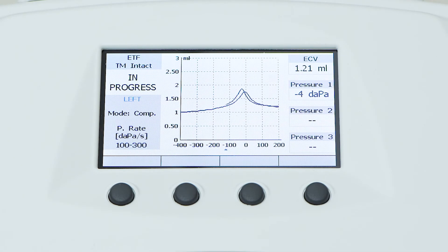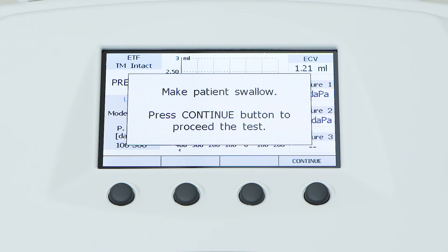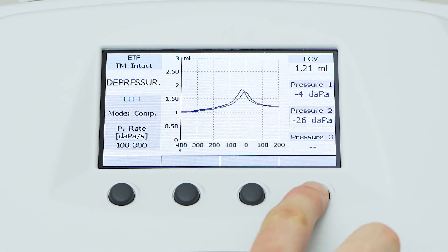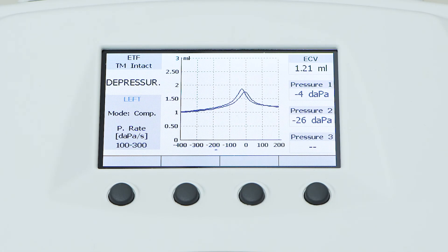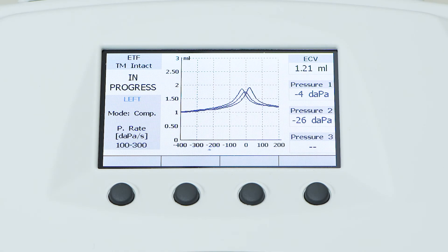The same procedure will be repeated for the recording of the third tympanogram. Results of the examination are shown on the right of the window, where the ear canal volume and the peak pressure values of the three acquisitions will be displayed.